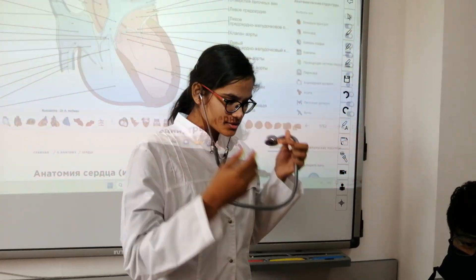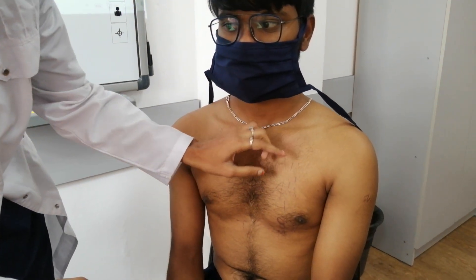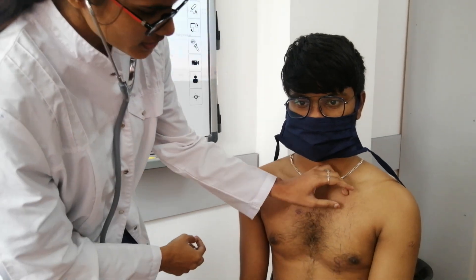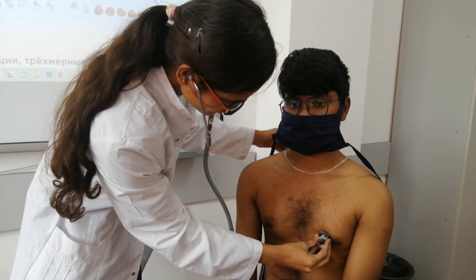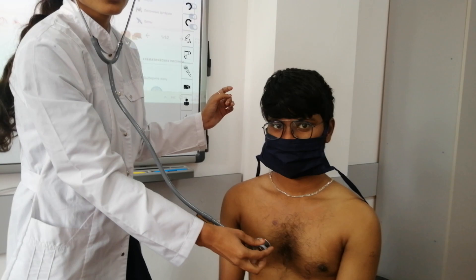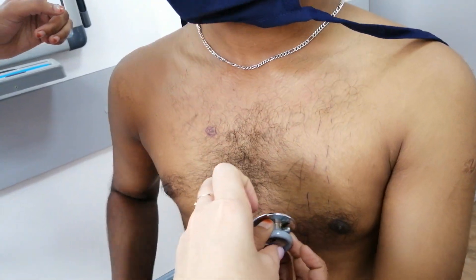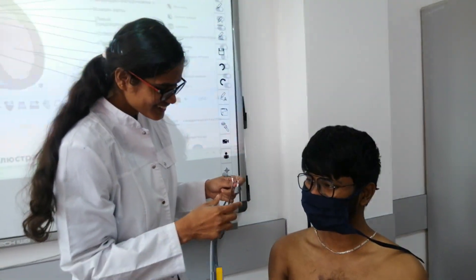First point: first auscultation point at fifth intercostal space, at mid-clavicular line — it is the fifth intercostal plane. Check if the stethoscope is working. Okay, it works.